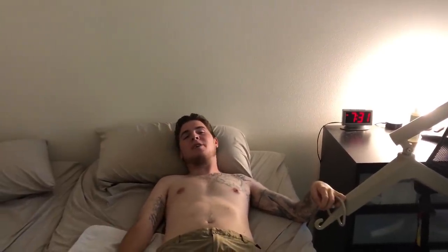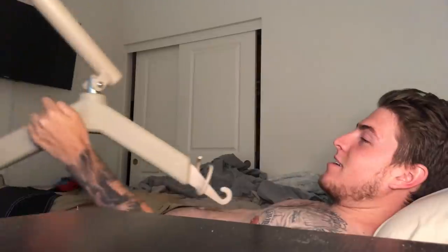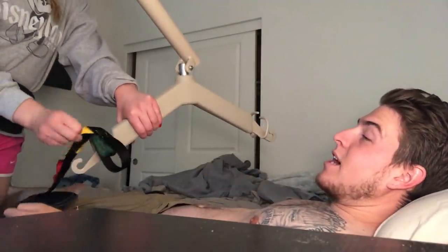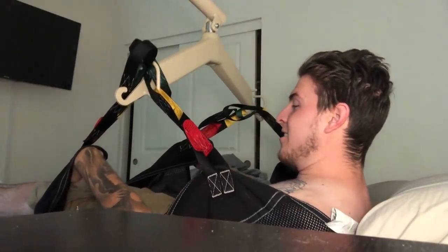Hey guys, good morning! Bri and I just woke up and she just got me dressed. We wanted to show you how she gets me from my bed back into my wheelchair using the Hoyer Lift. She's going to roll me over, put the sling underneath my back, then use the Hoyer Lift to lift me up and roll me back into my wheelchair. Bri and I are getting up pretty early — we're going to go to a swap meet this morning, so that'll be fun. All right, ready for the ride.